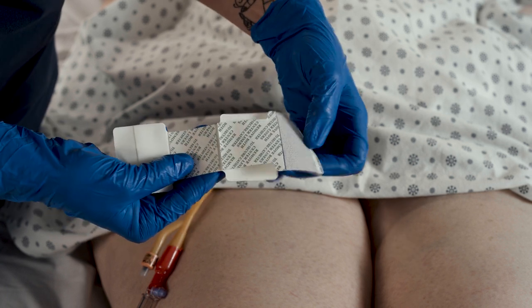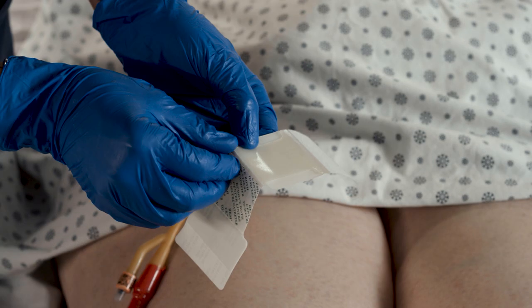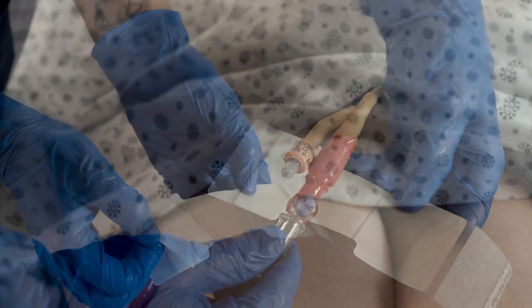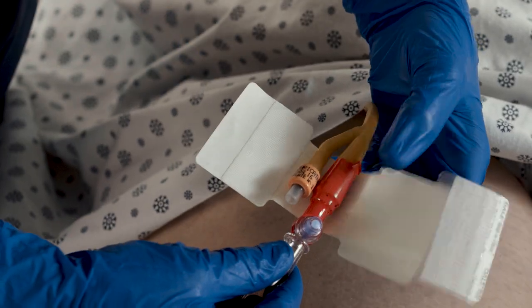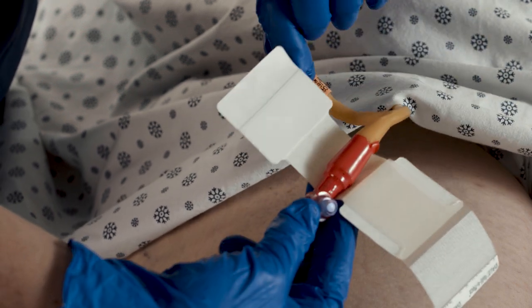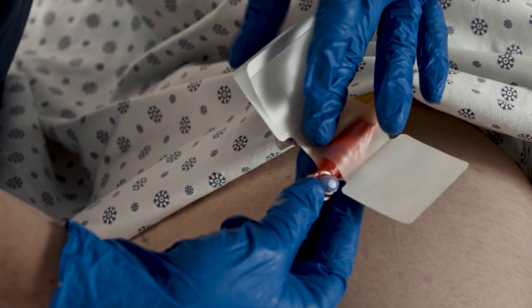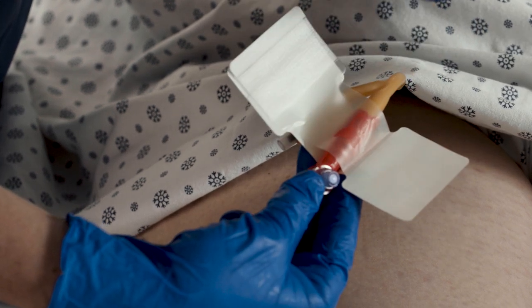Remove both center liners. Place the urinary catheter onto the exposed adhesive center. Carefully secure the catheter on the adhesive area. Fold the tab with the liner strip over the urinary catheter to secure it.